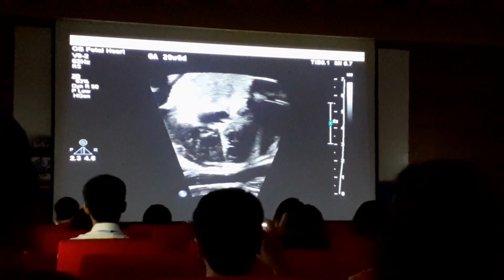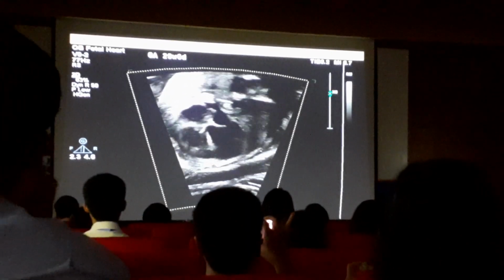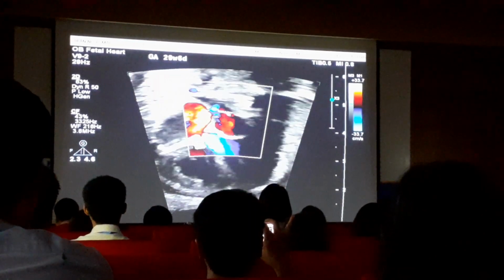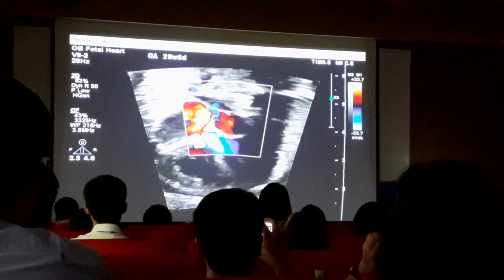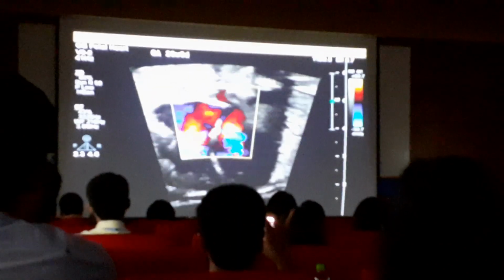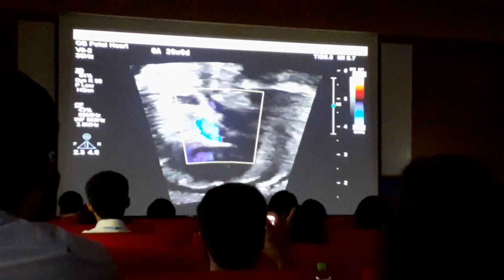Okay. We already saw the aortic valve on 2D and thought that it looked fairly normal. But we want to put color on that as well, changing the scale to make it appropriate.